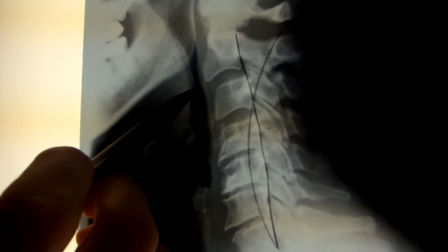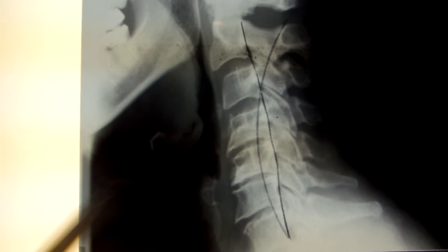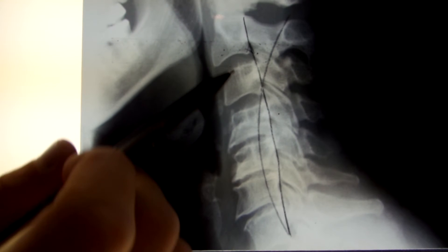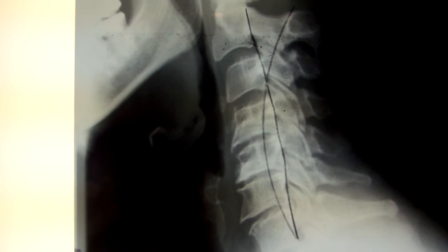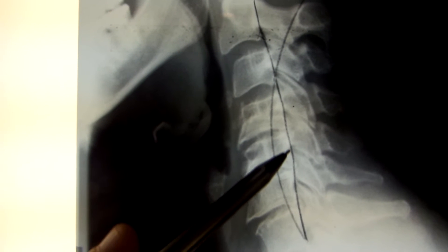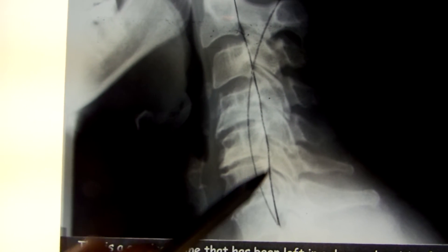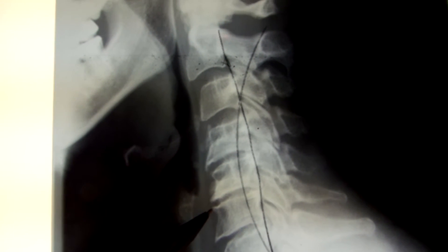In phase two of degeneration, we start to see some bone spurs develop — that's where it looks flattened out with points coming off. You can see that some discs look normal while others begin to degenerate, showing that it doesn't necessarily happen just because you're getting older. The curved line is what we want, but now the curvature is almost the mirror opposite — nearly flipped from what we want. At this point, we don't have to have symptoms, but typically we do.